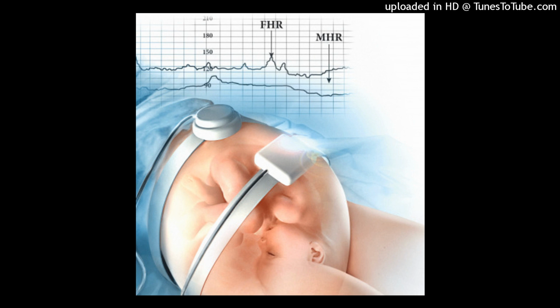Intermittent auscultation and palpation. IA, in conjunction with palpation, has been found to be an effective method of surveillance if performed in a consistent manner in accordance with professional guidelines. This method of assessing FHR and rhythm is done with a fetoscope, Pinard stethoscope, or handheld Doppler ultrasound. Unlike Doppler ultrasound, which translates fetal heart motion into a signal, a fetoscope or Pinard stethoscope allows the listener to hear actual fetal heart sounds, which include opening and closing of fetal heart valves.